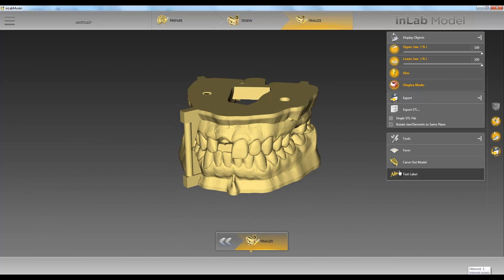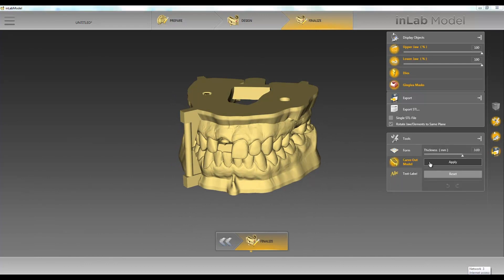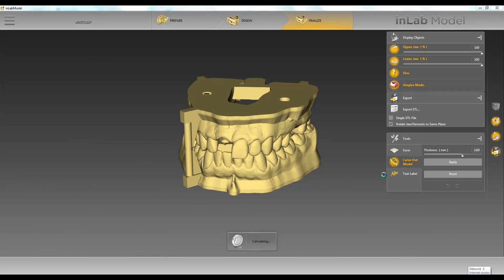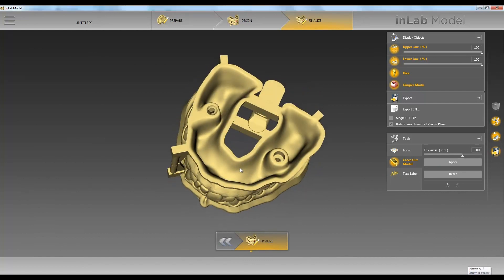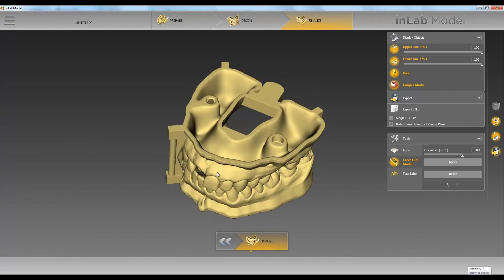First we'll go over carving out the model. You can let it know the thickness of the model that you want and then click apply. Now our model has been carved out.